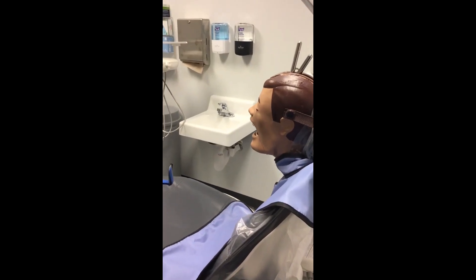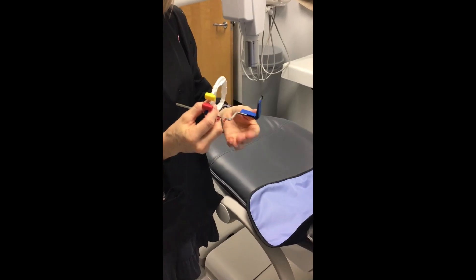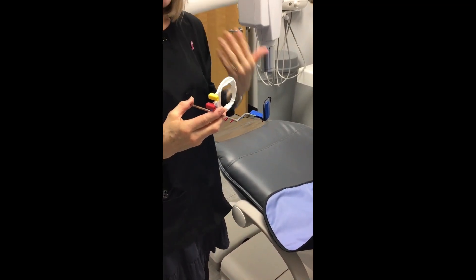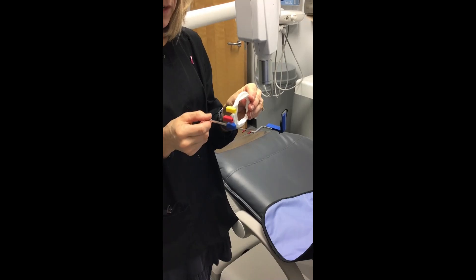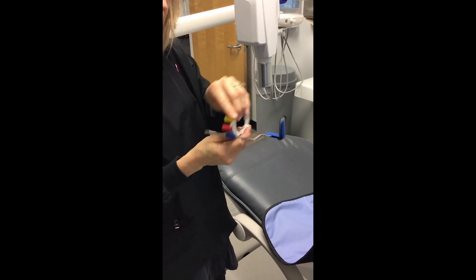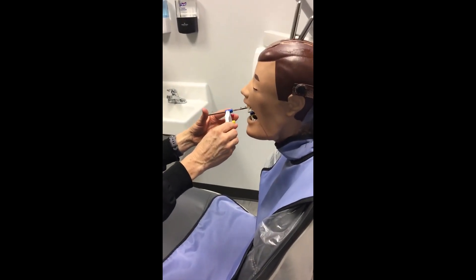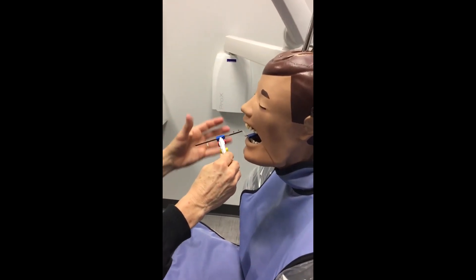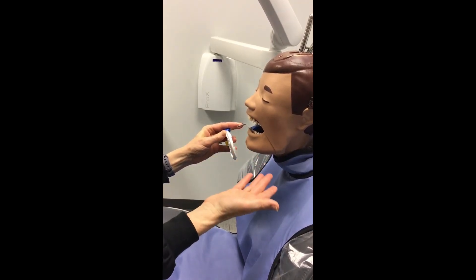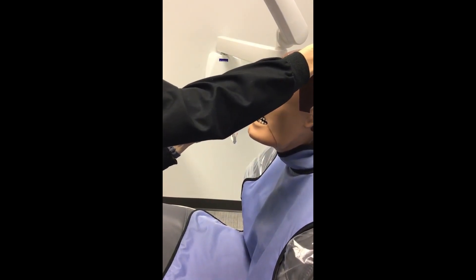For the mandibular arch, you will use a size one PSP plate. If you're using corded sensors, it is one size for all projections, but the technique is the same. For mandibular, you'll just turn your XCP so the PSP plate is on the bottom, not on the top like maxillary. Place your bite block on the teeth you're taking, with the line in the middle of the bite block between the two teeth you want on your projection — in this case, the mandibular centrals. Then have your patient bite down enough to hold the bite block in place.